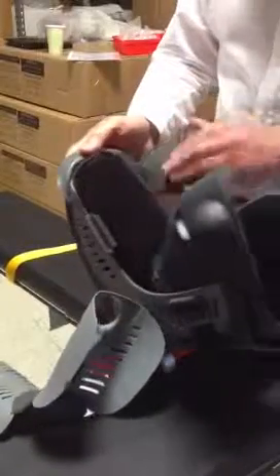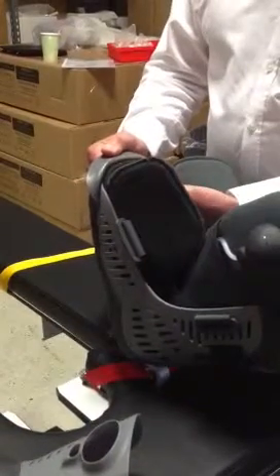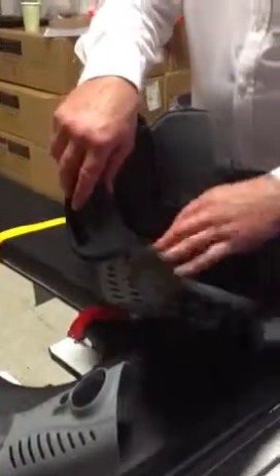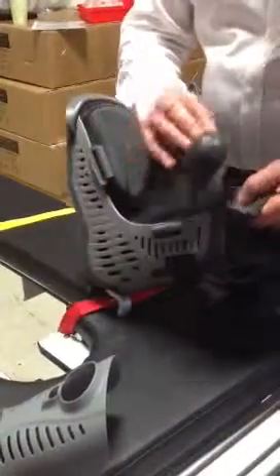Yeah, but you can peel that back, you can even cut it off. If the toes stick out of the front, actually it's a good thing because you can see in surgery that the foot stays in place. So normally we wrap, there's a sock inside the kit, or they can just wrap with a non-woven barrier material. Put the foot in, close it up, put the tongue in.